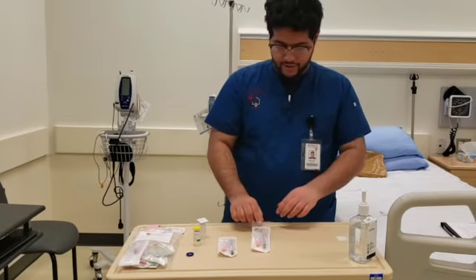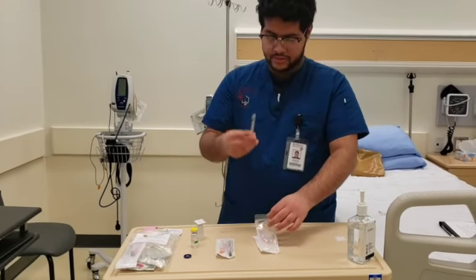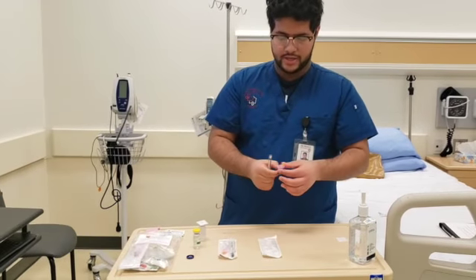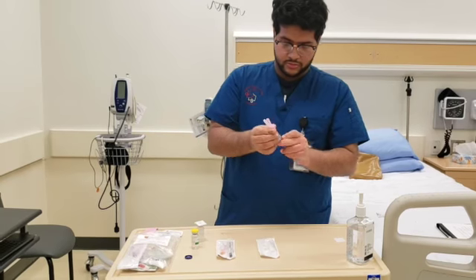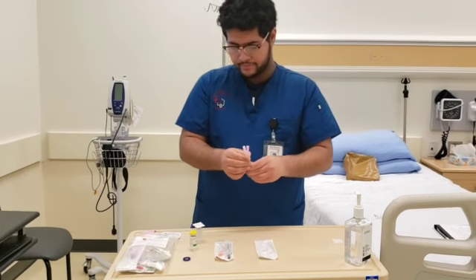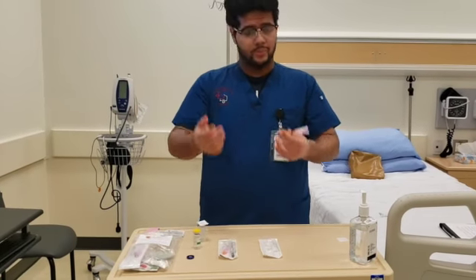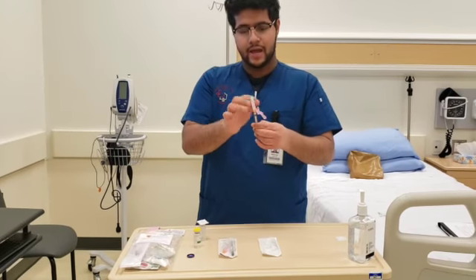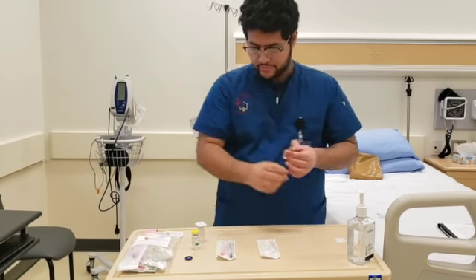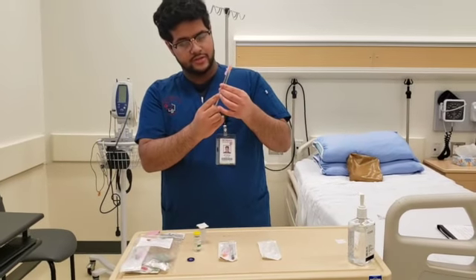And now we have our syringe. This is the 1 milliliter syringe, and then you put the needle. Going to luer lock it. Since heparin is 5,000 units per milliliter and the doctor has ordered 5,000 units, we're going to draw up 1 milliliter. That's perfect with the size of the syringe. Going to put the safety cap back, take this off. Still sterile. I'm going to put in 1 milliliter of air in this.